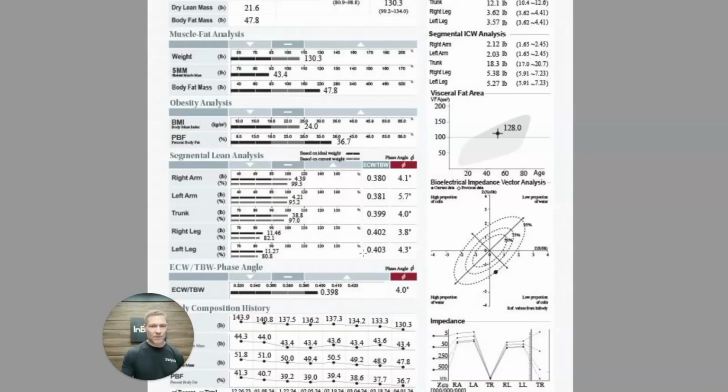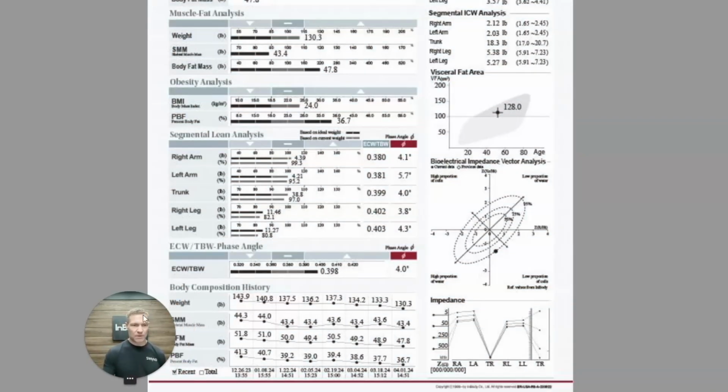Okay, then we're going to make our way down to body composition history here. And the one thing I want to convey here is just trends. One scan never tells the whole story. It can be a great starting point. It can tell us where you're at on that day. But what I'm really looking at is trends over time. So it's so important for us to do regular InBody scans. Come in and scan every couple weeks so we really know how you're improving. Because again, one scan is never going to tell the whole story.